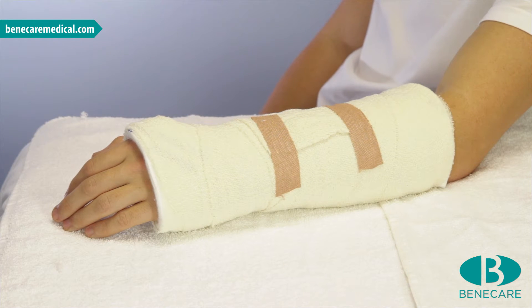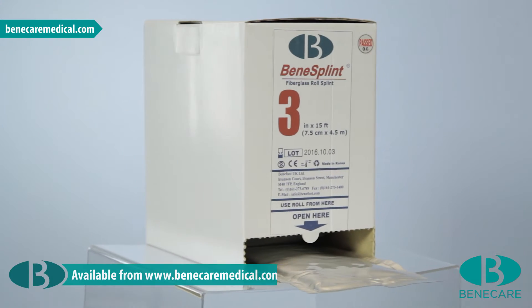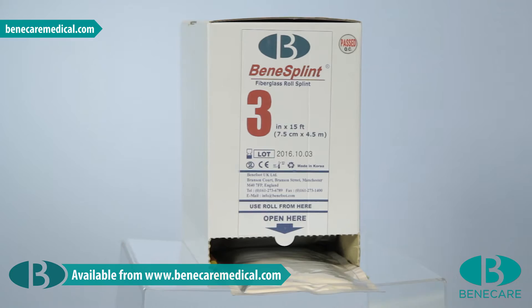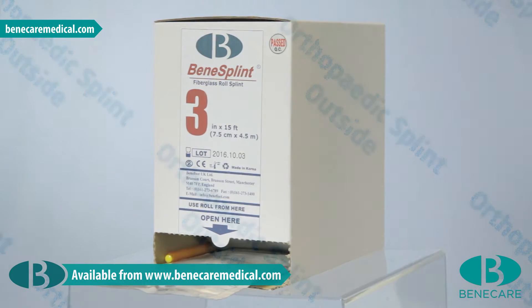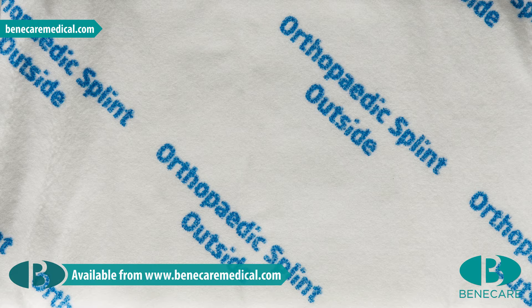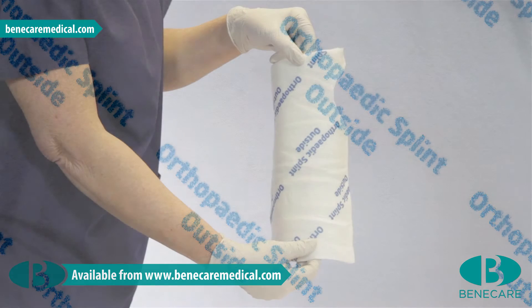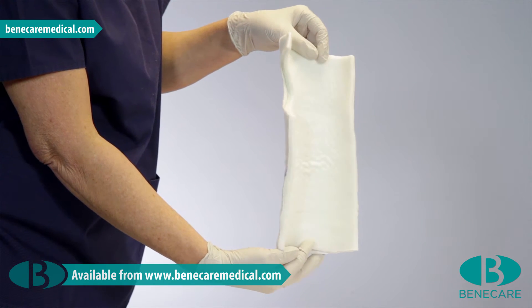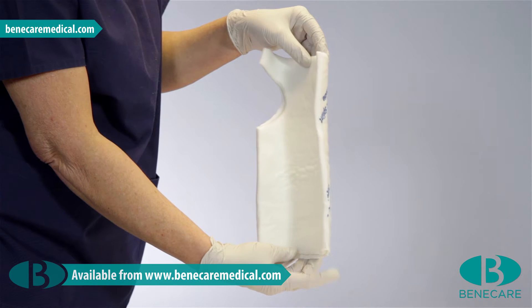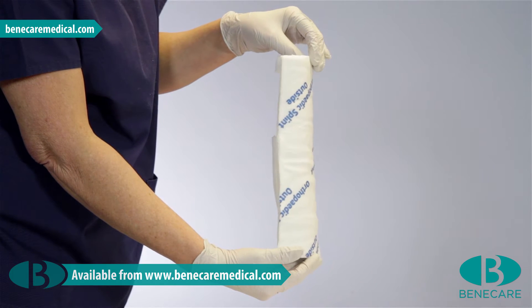Today I am going to apply a below elbow splint. The product of choice is Benicast splint on a roll, which is a pre-padded synthetic splint. It can be used as a primary or secondary treatment. This type of splint is extremely strong, durable and also washable. It is suitable for swollen limbs and can be removed for wound care, physiotherapy and personal hygiene.